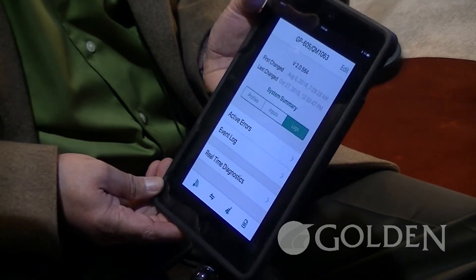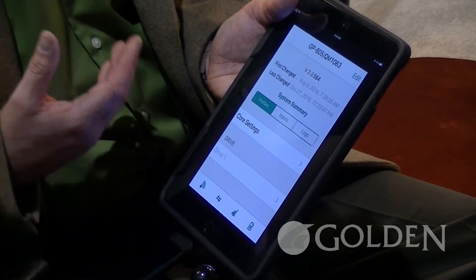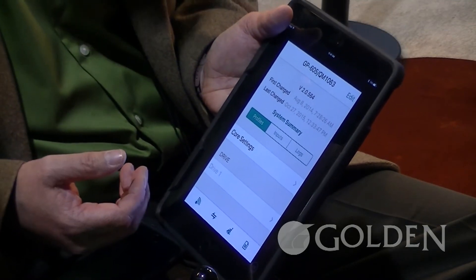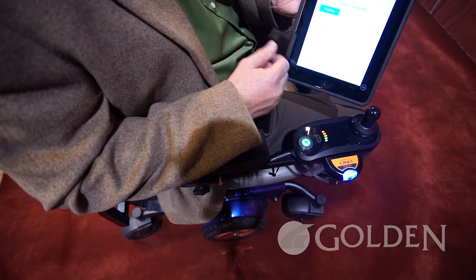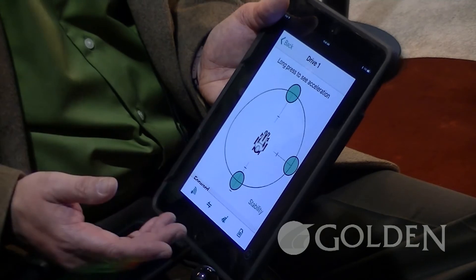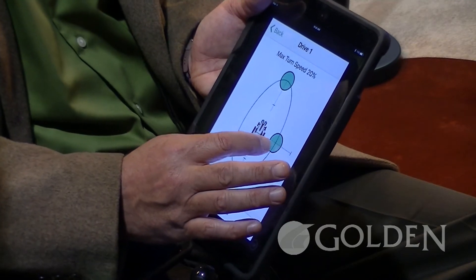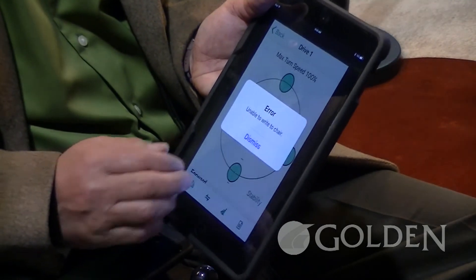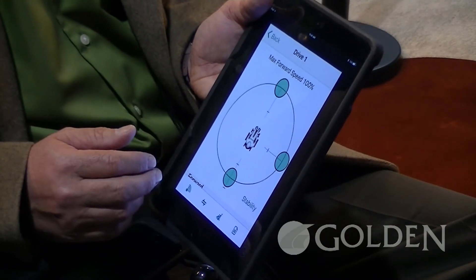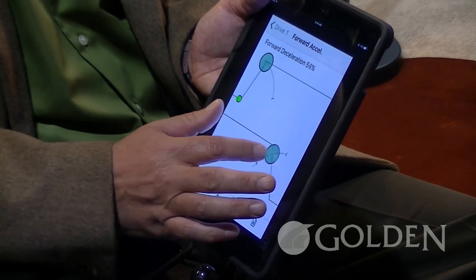Another really nice feature of the Dynamic Links is profiles. When you go to program a chair — as was done years ago or even today with other products using a handheld programmer — with the Dynamic Links, we can change the parameters of the drive modes. We go to drive one settings, and to change the turning radius, we just use this and nothing else. It's fast, it's reliable, and it's accurate. Same with forward speed — for acceleration and deceleration, we just hold the button in one place and now we can accelerate or decelerate the chair.